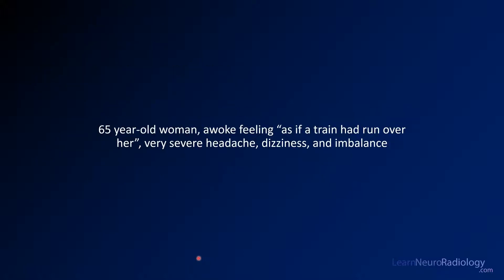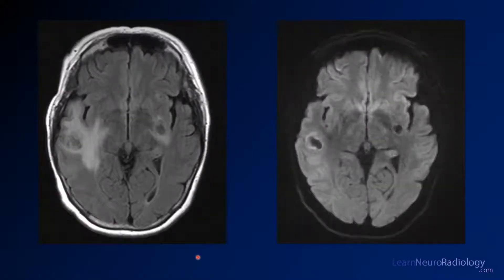Now we have a case of a 65-year-old woman who awoke feeling as if a train had hit her, and now has a headache, dizziness, and imbalance. Here you see a FLAIR and diffusion image through the central portion of the brain at the level of the basal ganglia. There's a relatively low T2 mass and another low T2 mass with surrounding edema. They're not very bright on DWI — one has a little brightness around the rim, the other is relatively normal on DWI.